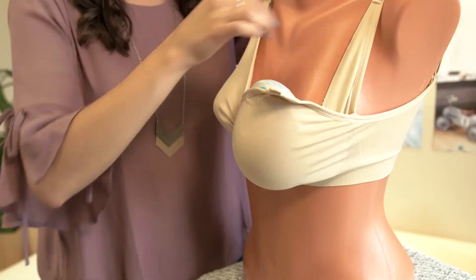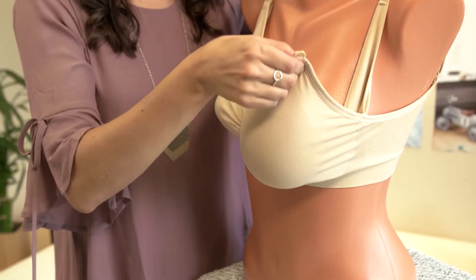We're here to talk about air in the bag. I have some tips that may help reduce the amount of air in the bag. The first is to always make sure there's no fabric between Willow and your breast when you close your bra.